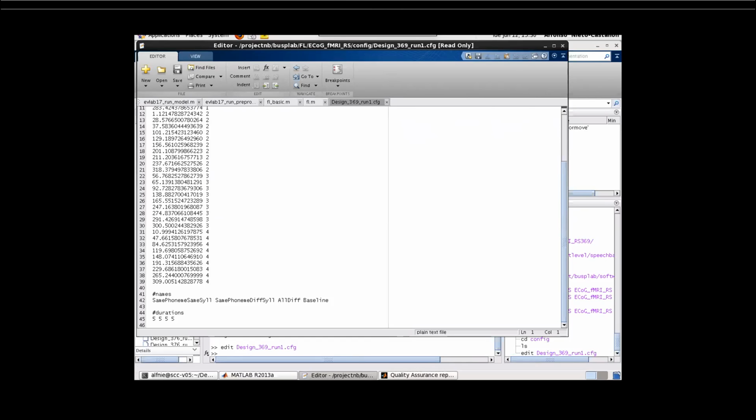I also think I need to look deeper into whether these onset times match up from the scanner, right? But it might be that in the new versions it's not needed to correct for that.